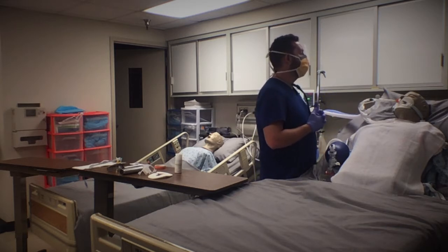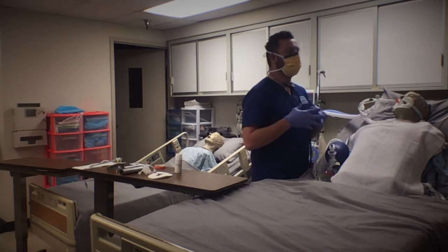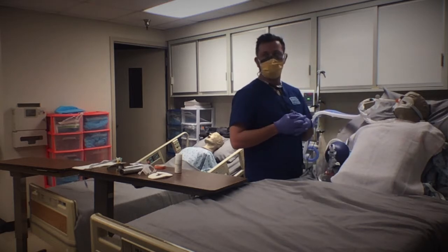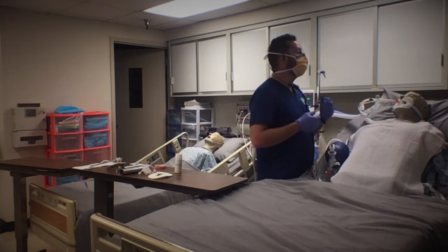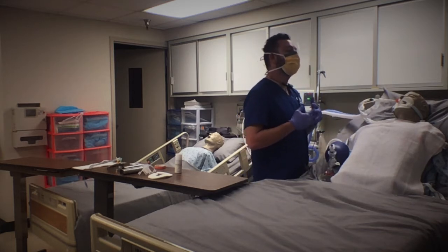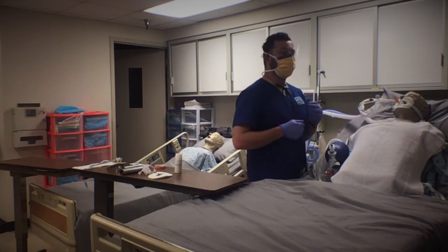So moving on to step 6, we're going to apply the appropriate oxygen and humidity therapy. Patients who have been receiving mechanical ventilation may still require O2 therapy, usually at a higher FiO2. Other patients may require some O2 because this is a stressful procedure. If humidity or aerosol therapy is indicated, most clinicians suggest a cool mist immediately after extubation.